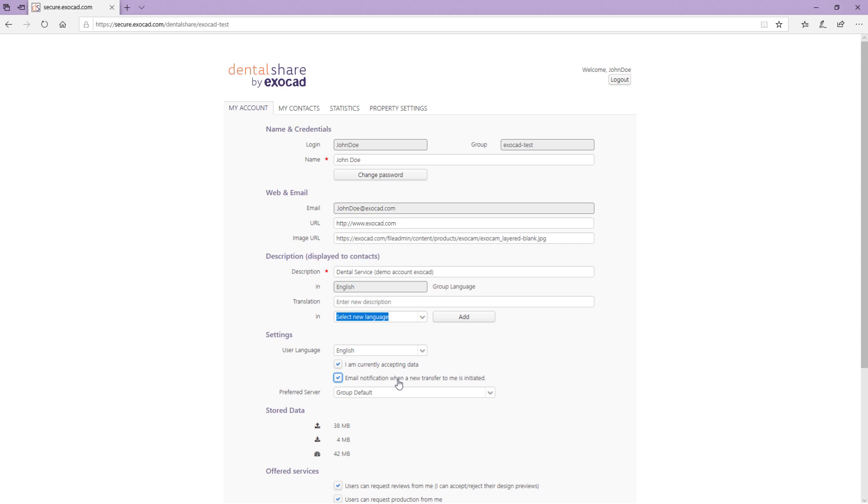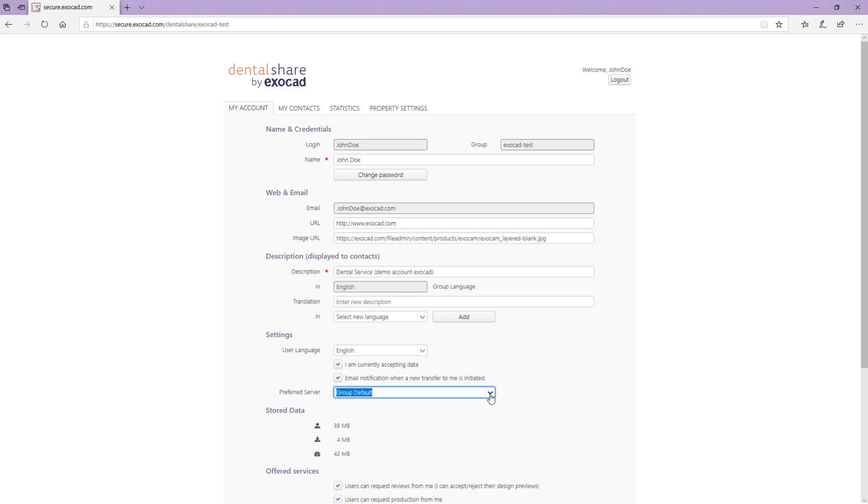In the preferred server drop-down menu, you can select between different servers in different countries. It is recommended to select the nearest server in order to achieve ideal upload download rates.